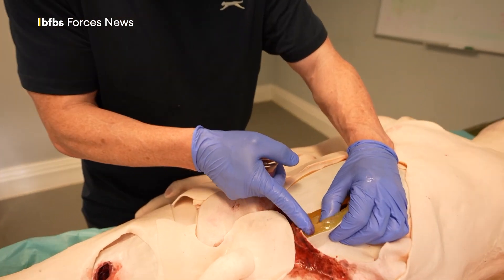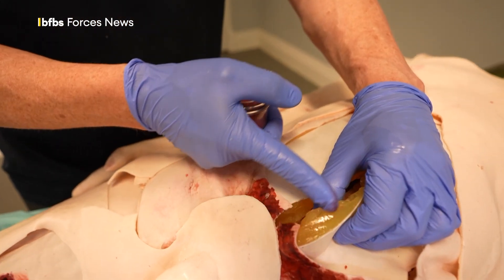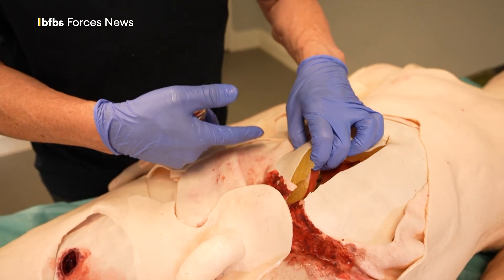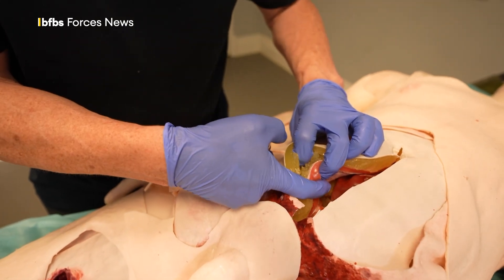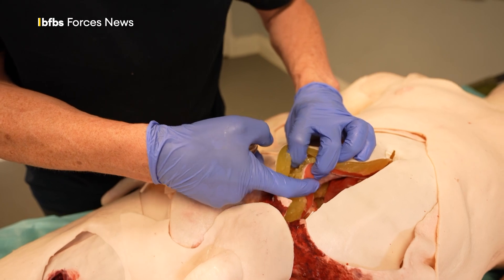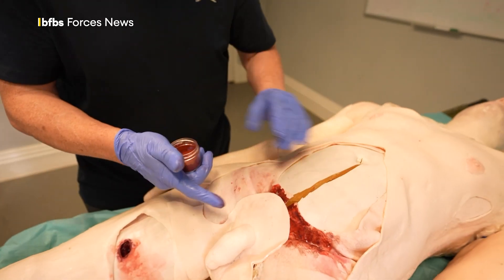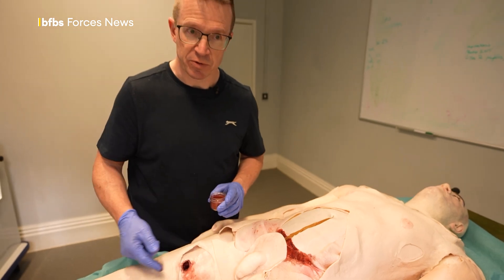The silicon simulating the fat has got a certain greasy quality to it, and when this gets the theatrical blood on it, it becomes very, very slippery indeed, helping to simulate the realism of the sort of tactile feedback. The muscle is very elastic, similar to the skin, but again it is a reasonable reproduction of the actual textures of human tissue.